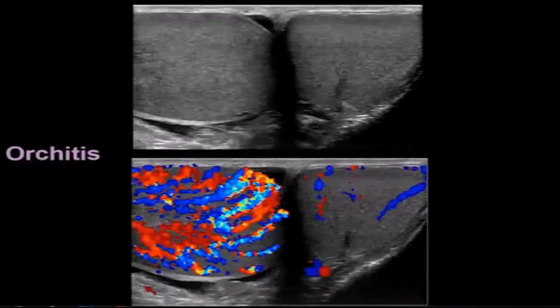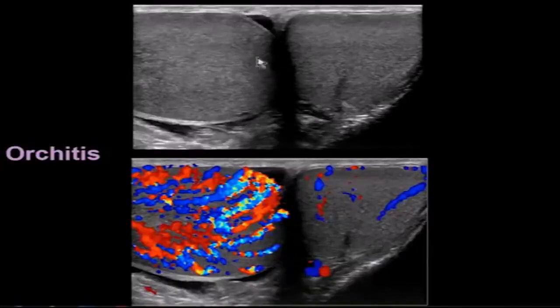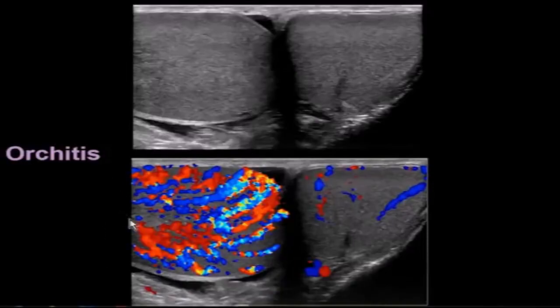Here's a patient with orchitis. On the side-by-side view of the left and right testicle, the right testicle is mildly enlarged. The echogenicity is pretty homogeneous but not quite as smooth as the left. When we put color flow on, we can see marked increased blood flow inside the involved testicle as compared to the normal left side — look at all those vessels traveling across the inflamed testicle.